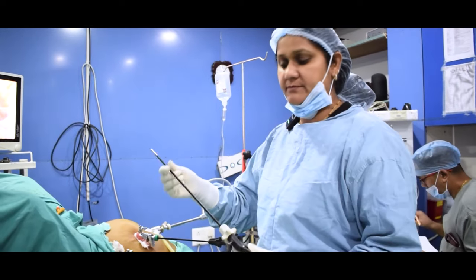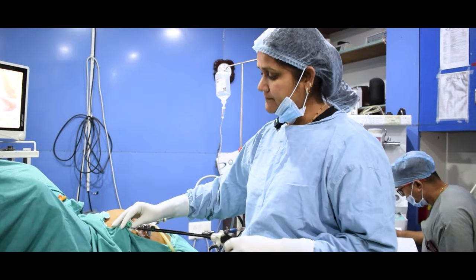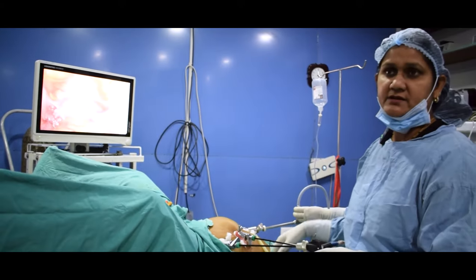Through these ports, a camera is inserted into the abdomen, which gives us a full picture on the screen where we can see everything inside clearly.